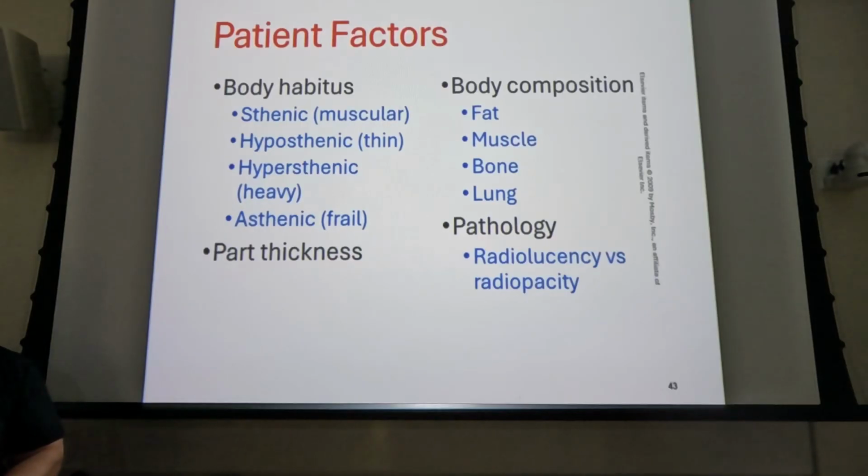Well, sort of. Is death a disease? I don't know. It's the end result of a disease. But what you get in post-mortem images is the blood tends to settle in the great cavities, which is kind of like the patient having ascites.